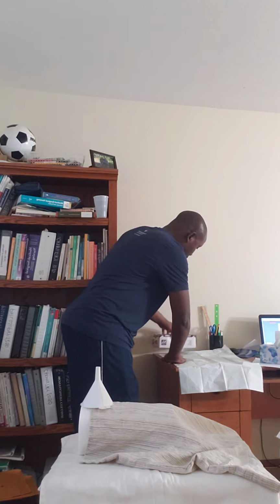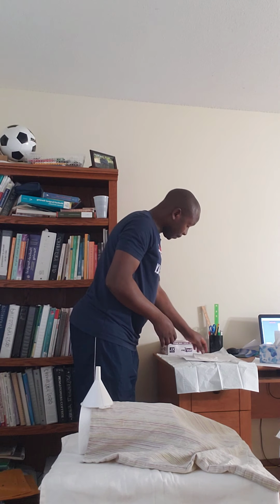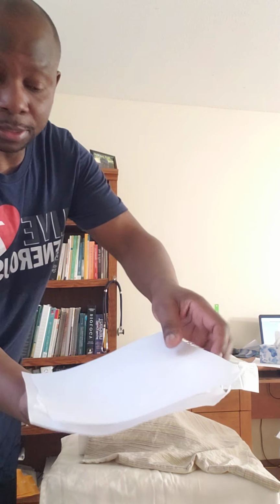So this is sterile. Here you can see it is sterile. While I set up this one here, I'm going to have gloves in my kit. Inside my kit, there is the first kit that is on the patient. There are sterile gloves in my kit. I put them over here. The gloves are covered inside of this one. Pretending these are gloves, you can see, but inside they're sterile.